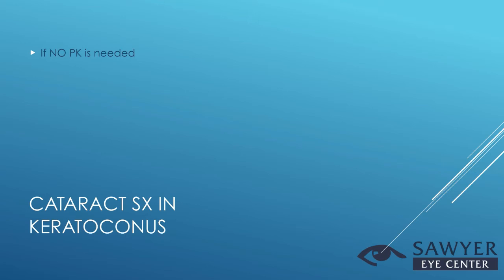Most of the time you're taking someone from a large amount of astigmatism, 4, 5, 6, 7, 8 diopters of astigmatism, and reducing it with a toric lens to 1, 2, or 3 diopters, which obviously creates a much greater quality of vision, better quality glasses afterwards, but is definitely not enough for them to see everything without glasses. So you always want to emphasize this will not get you out of glasses if we use a toric IOL, but it will get your glasses prescription to a much more reasonable level.